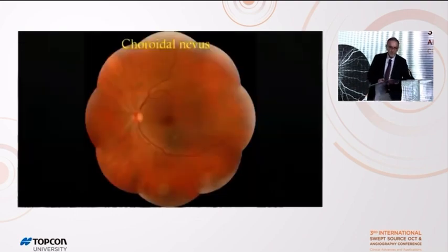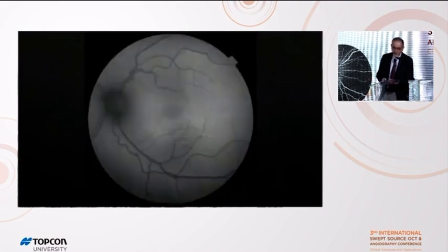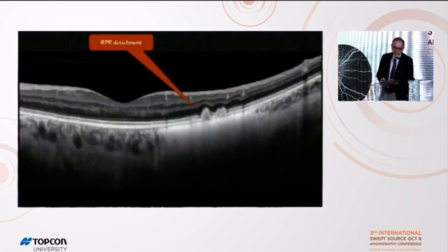So this is another patient with, again, choroidal nevus. This is the left eye, and this patient had this lesion along the inferotemporal arcade. As you can see here, there are lots of drusen on the lesion surface. And this is the fundus autofluorescence image showing tiny pinpoint hyperfluorescence on the lesion. And this is the swept source OCT image. Basically, it shows the same features as discussed in the previous patient. But this patient also has drusenoid retinal pigment epithelial detachments, which also is a sign of chronicity.